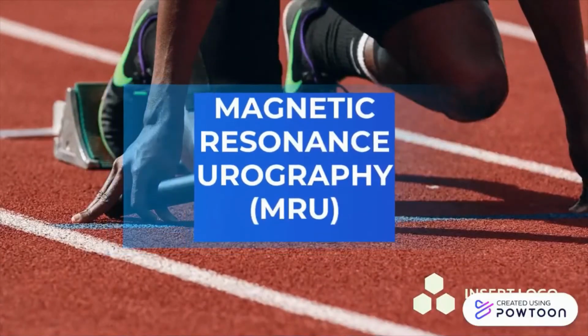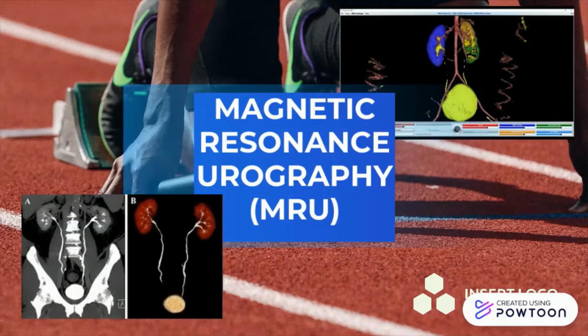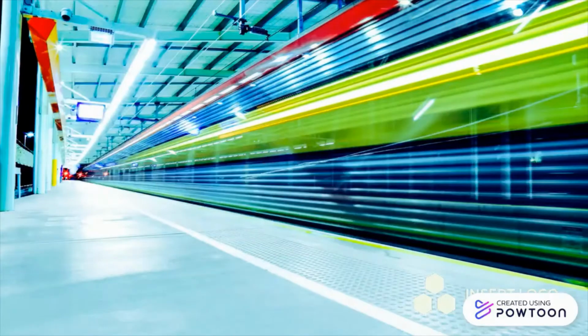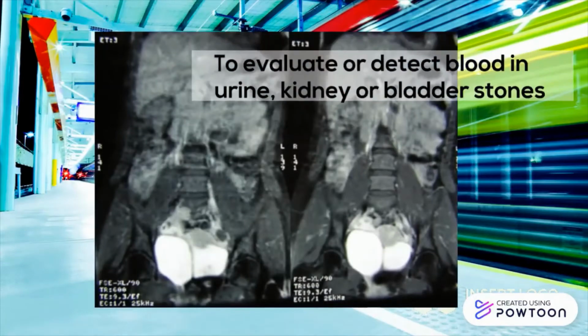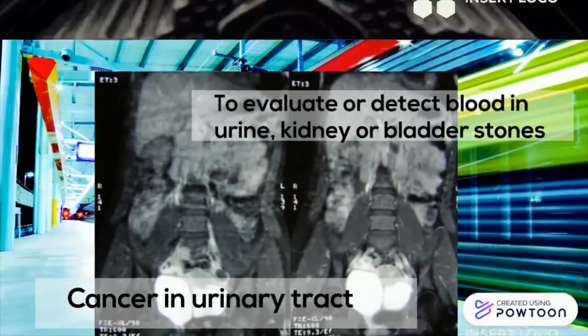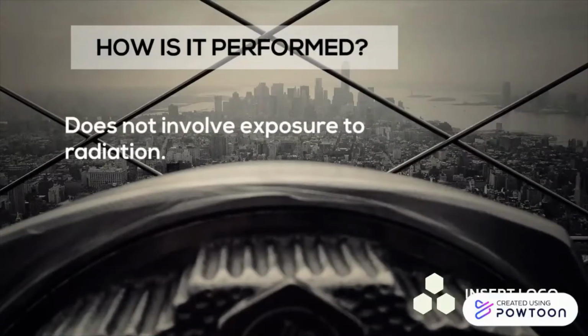Hi, today I'm going to give you a brief on a device that helps to treat kidney diseases, which is magnetic resonance urography, also known as MRU. What is MRU? It is a device used for imaging to evaluate or detect blood in urine, kidney or bladder stones, and cancer in the urinary tract.